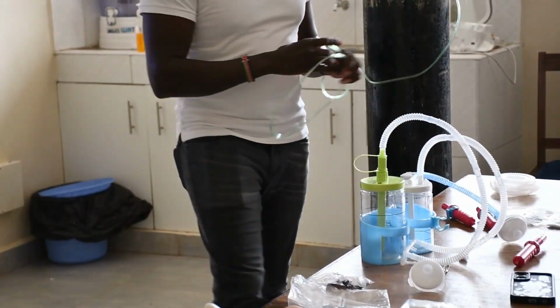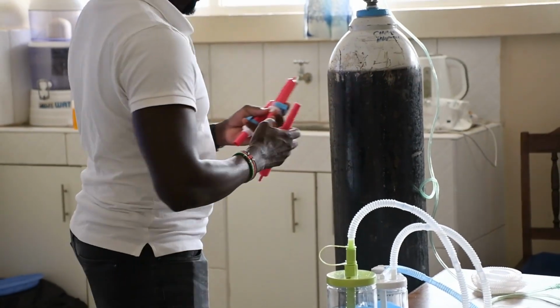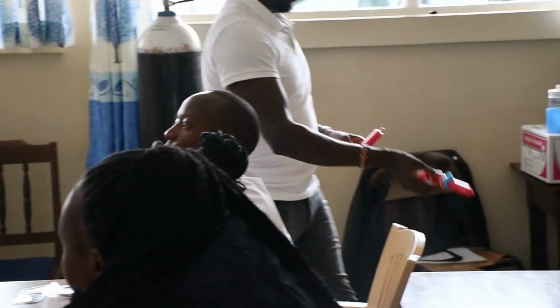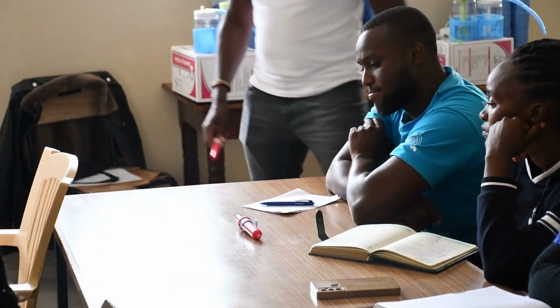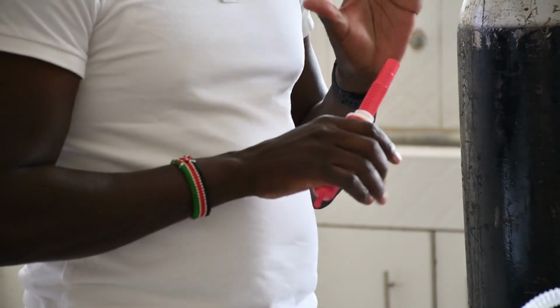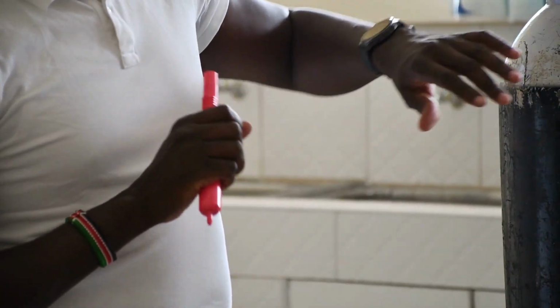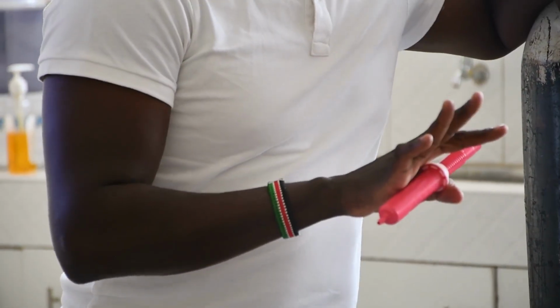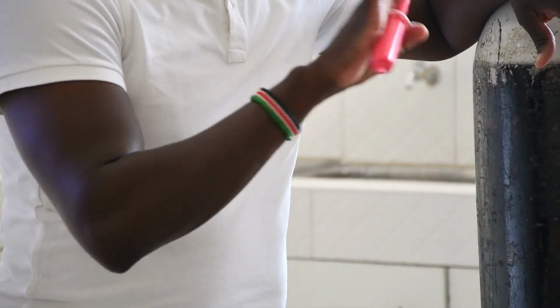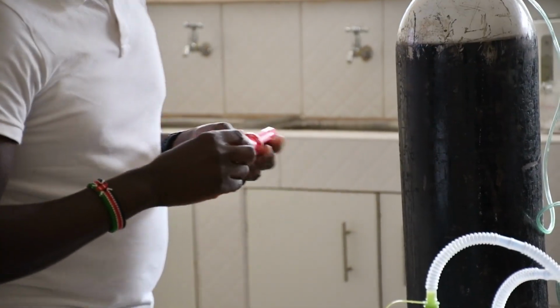Then after that, you come to the blender. This is a very innovative part of the device. This is the part of the device that enables us to blend without the use of electricity. So we're going to go back to some physics, very simple physics. So what is happening is this.